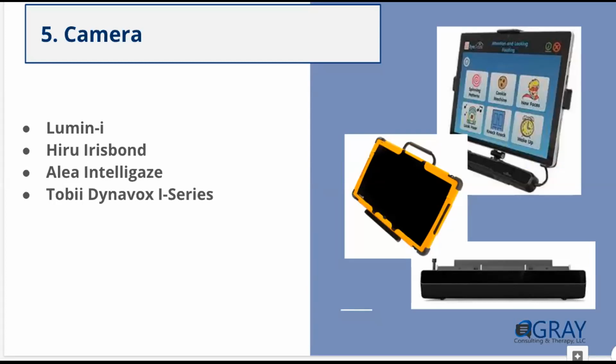The other thing that you might not be aware of is that there are lots of cameras out there and lots of camera options. So the camera that is on the Tobii Dynavox is not the same camera that is on the PRC device. And Grid Pad through Smartbox offers several camera options. And so those cameras are each going to be a little bit different. And because the algorithm is based on someone, one algorithm might be better for one person's eyes than another algorithm.